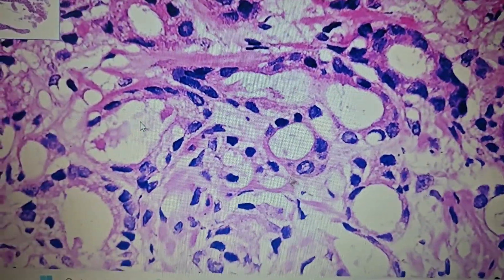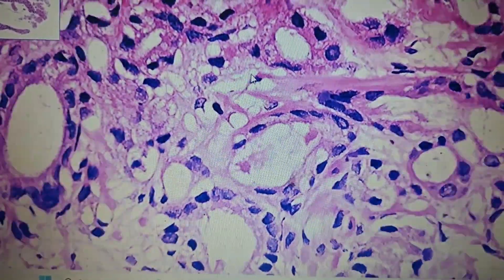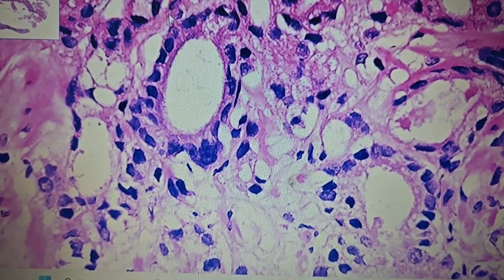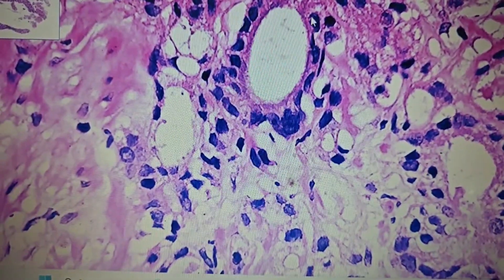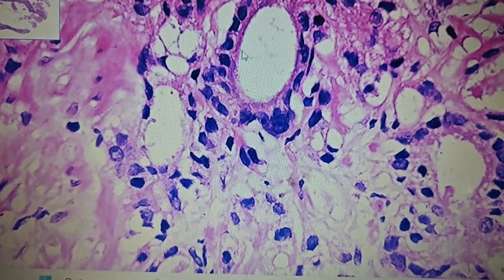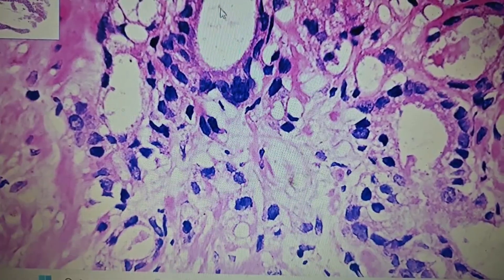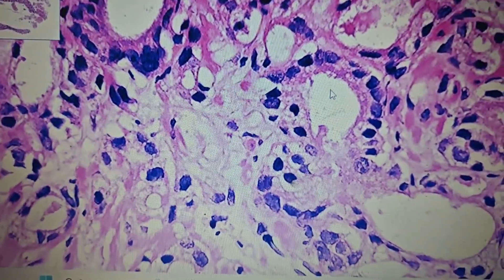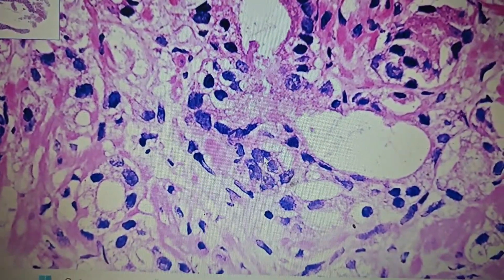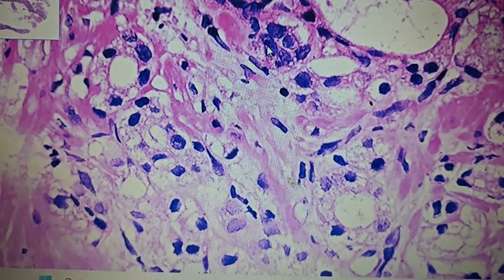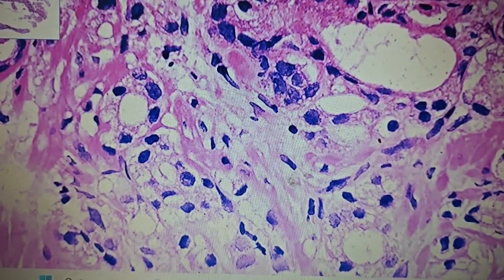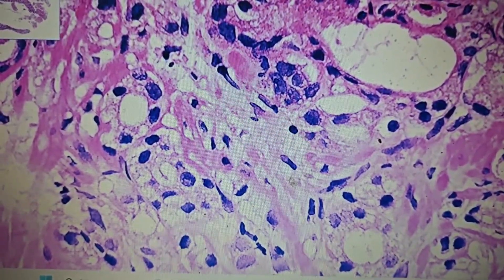These are the malignant prostatic glands seen in a case of prostatic adenocarcinoma. The important points are: the glands are small in size with round to oval lumens, lined by a single layer of epithelial tumor cells, showing nuclear atypia, and at places you can notice prominent nucleoli inside the nuclei. This is a case of prostatic adenocarcinoma.